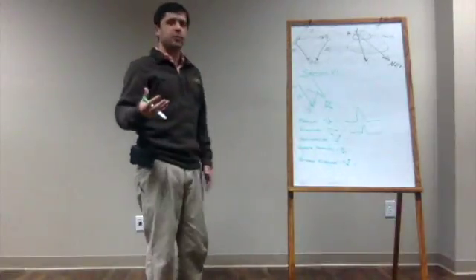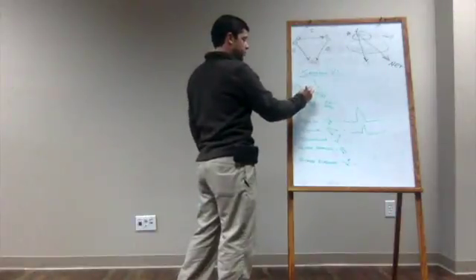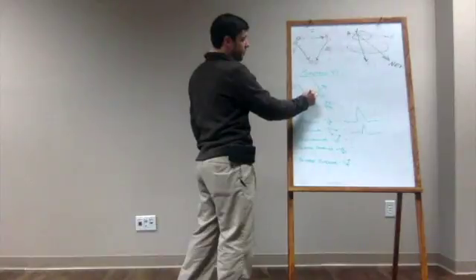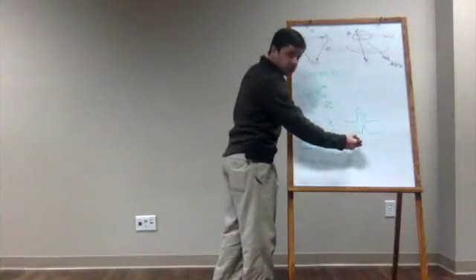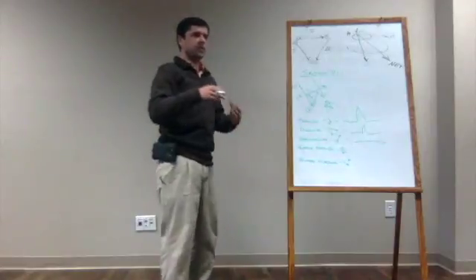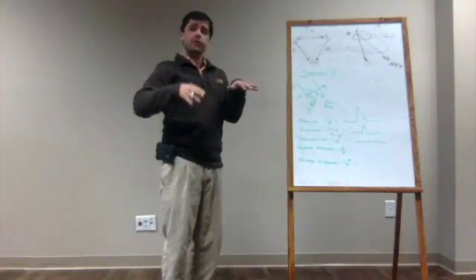And going even further with that, there are some conduction paths that move perpendicular to our view lead. When I say perpendicular, I don't mean kind of, I mean at a perfect 90-degree angle. When that occurs, you will either get no deflection whatsoever, or a biphasic deflection. And a biphasic deflection is the same height upward as downward for a net of 0.